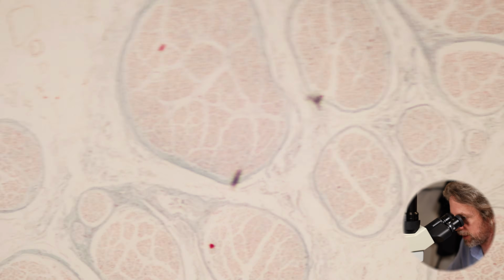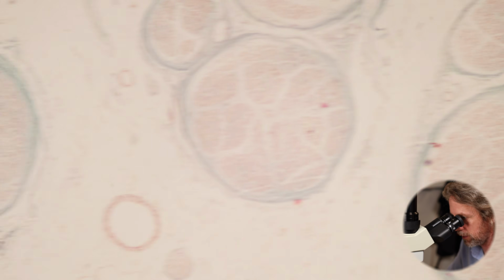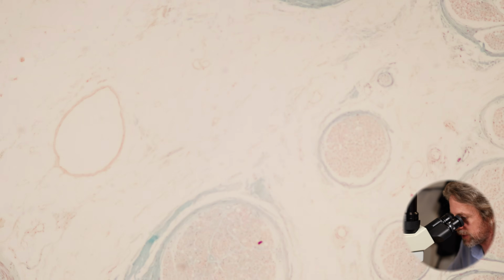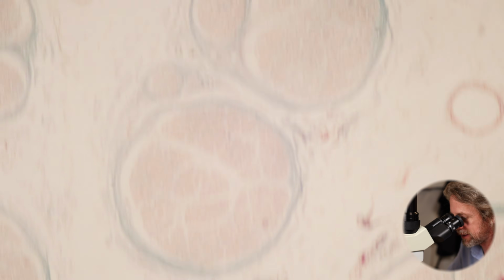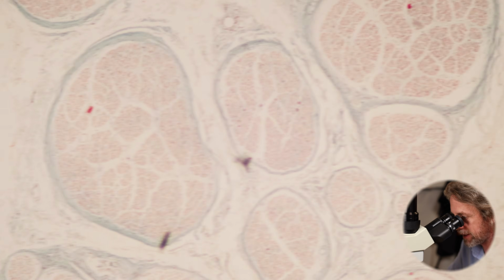A lot of the spaces here are artifactual. I think some of this is separated with sectioning and fixing and what have you. But we've got different size bundles. This is another then key idea about nerves, is that a peripheral nerve is a mixed nerve.